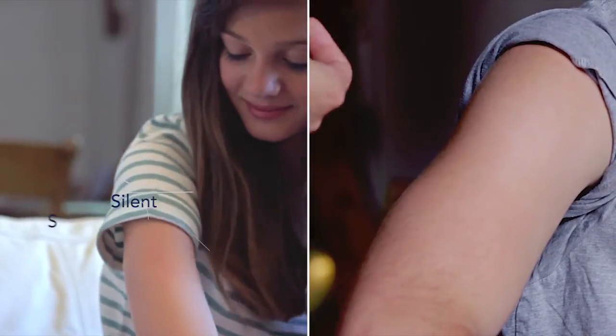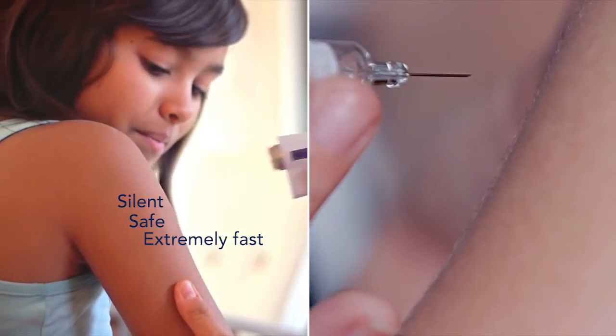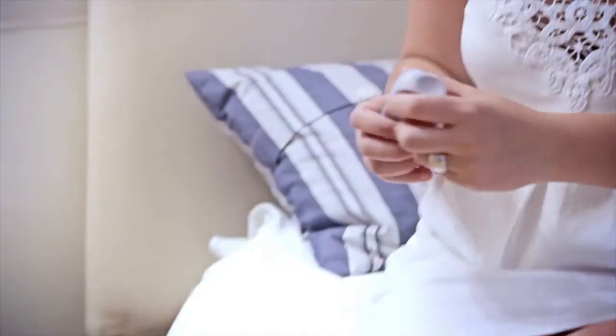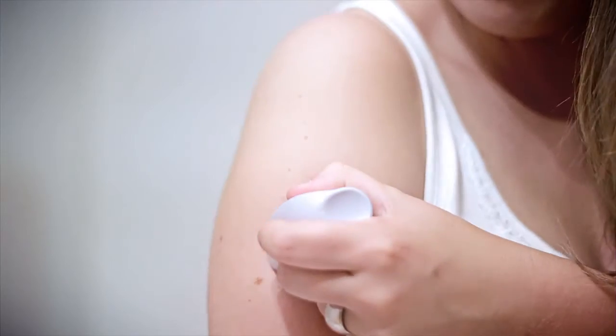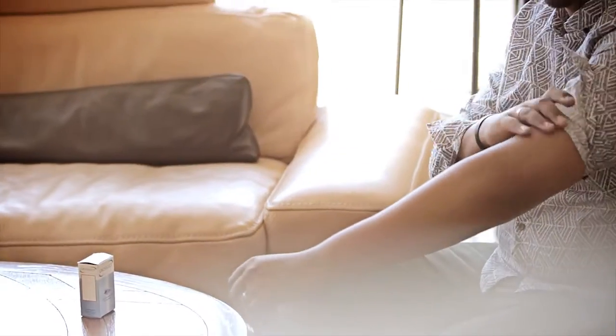Injection with Zinio is particularly silent, safe and extremely fast. It takes less than one-tenth of a second. Either you inject or you do not inject, but you cannot miss your injection.